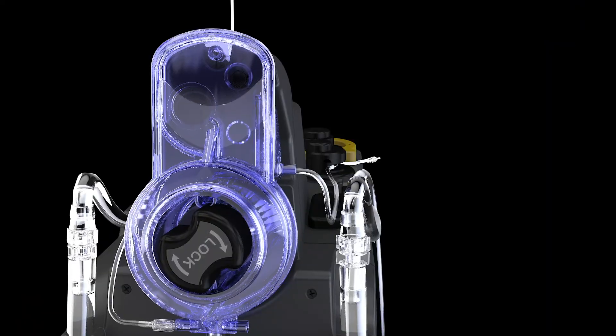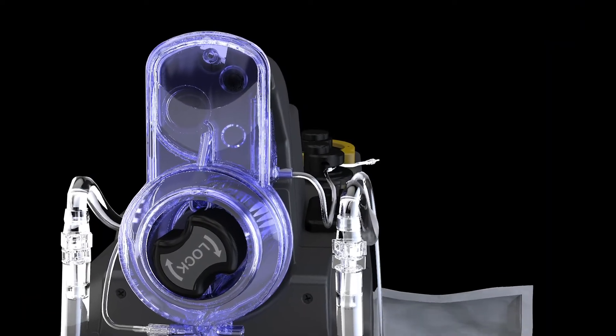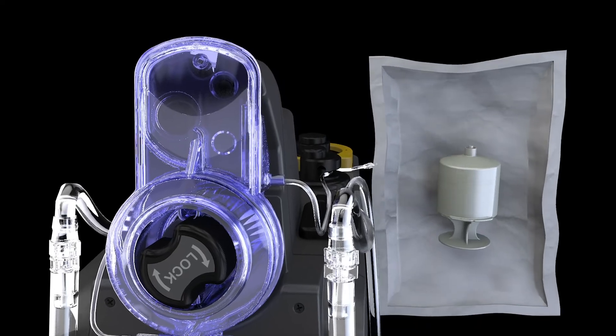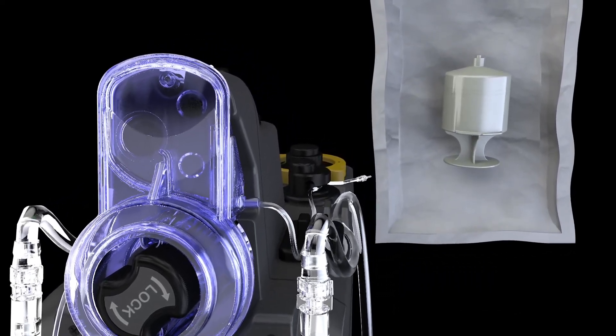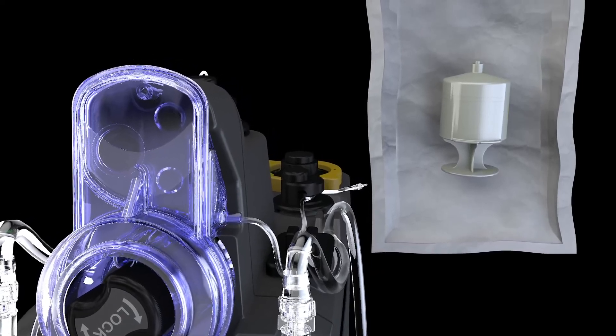Next, pick up sterile packaging containing the yellow arrest cartridge. With angled seal in hand, slowly peel open. Take cartridge out of packaging while maintaining sterility.